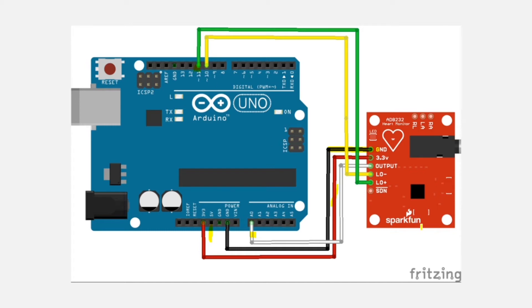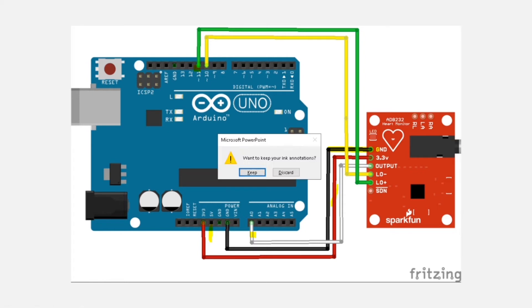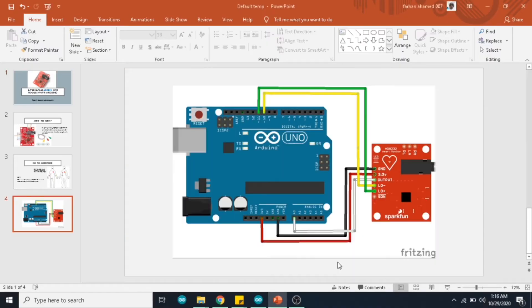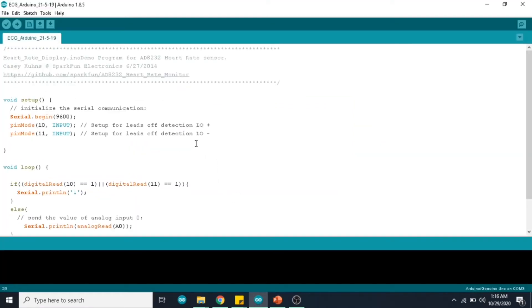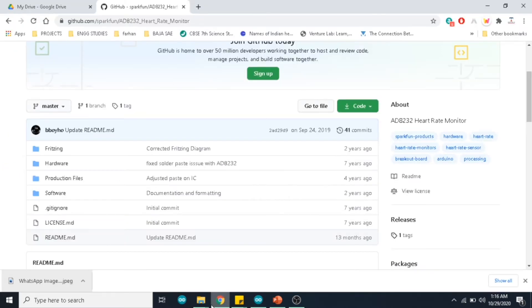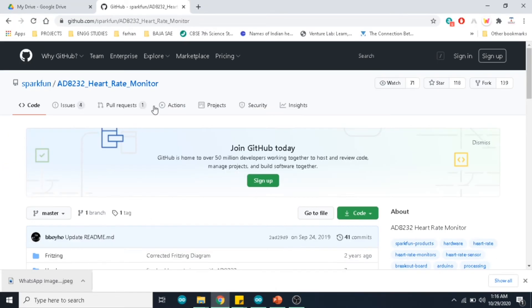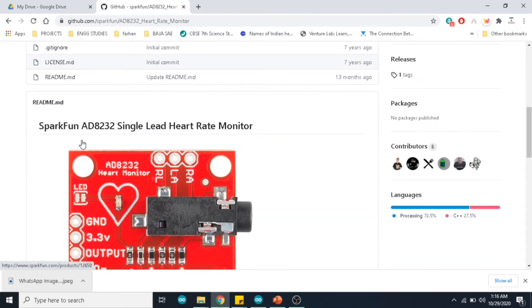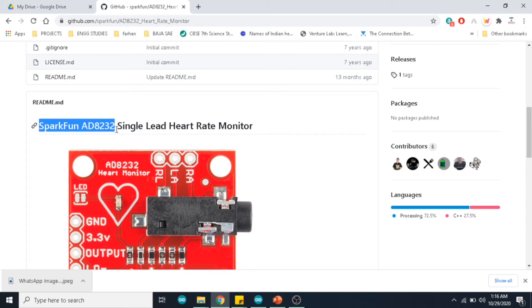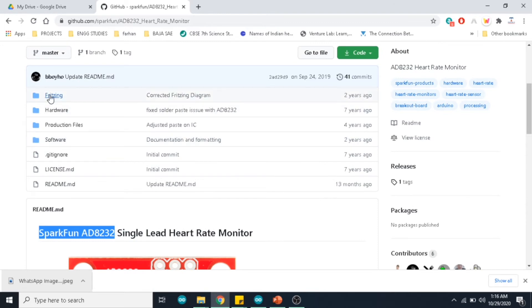This is the circuit connection. Now we will look into the coding. This is the code that we are going to use. I got this code from this GitHub library made by SparkFun. This library consists of all the files related to the SparkFun AD8232 single lead heart rate monitor, the Fritzing files, the hardware and software. All the files are available in this link.